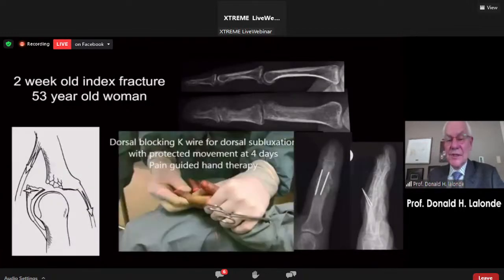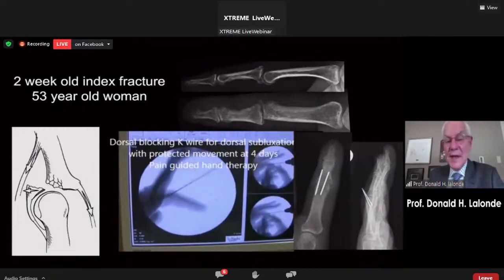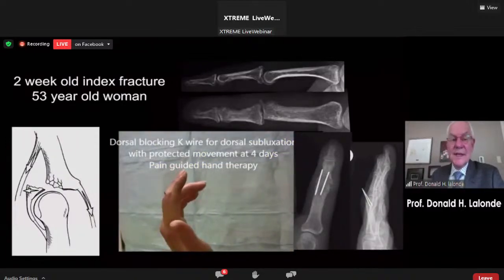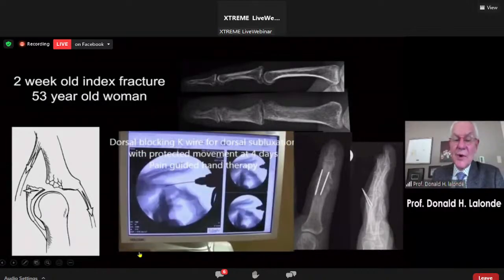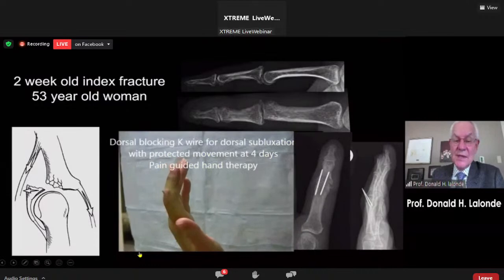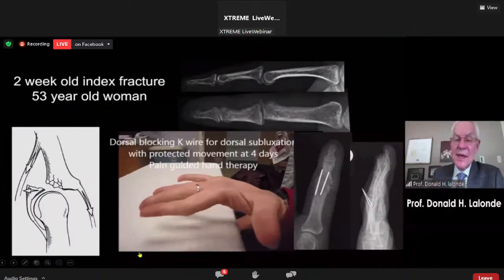In dorsal dislocations, I like to use these dorsal blocking K-wires, and it stops the middle phalanx from subluxating dorsally. And in this case, it was 2 weeks old. And yet I pushed that fracture down into reduction. We started early protected movement at 4 days after the K-wiring. There you see me putting in the K-wires. You see me testing the movement during surgery. You see me starting early protected movement at 4 days with pain-guided hand therapy. And you see the final result.